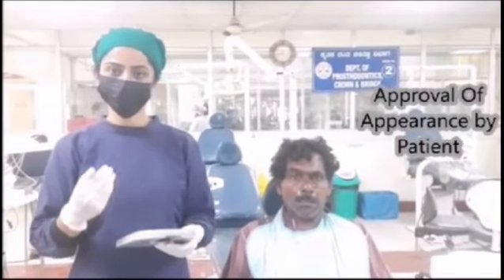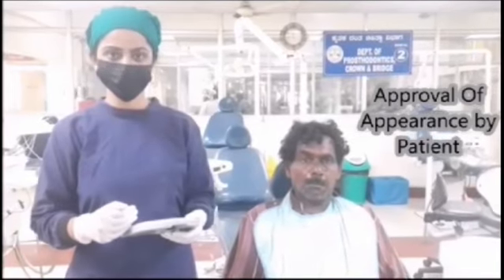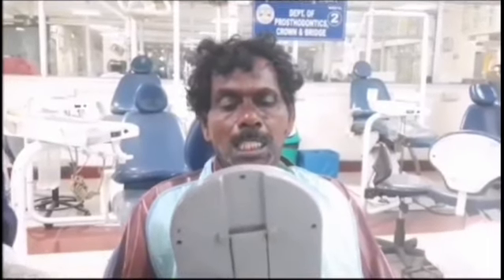Approval of appearance by the patient. It is mandatory for the dentist to obtain patient approval or consent for the appearance of the trial denture. It may be advisable to ask the patient to bring a close relative or a friend during try-in, and the approval and suggestion of this person can also be considered if realistic and reasonable.